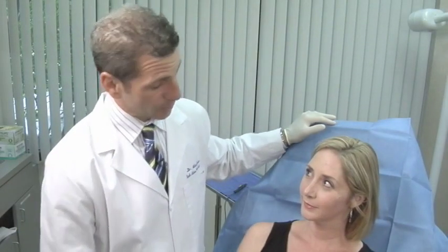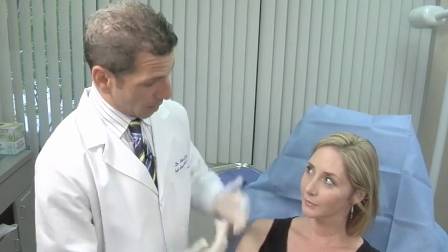This is Leanne, and she comes in with some — what we see in our patients a lot — which are just some pigmented and even some non-pigmented nevi, and even some little lumps and bumps on her face, and she doesn't want any scars. I've been using a radiofrequency technology for 19 years where I will remove these with a loop radiofrequency device from Elman. I think we counted five little lesions on Leanne on her face and neck — it'll take me probably about a minute and a half to two minutes.